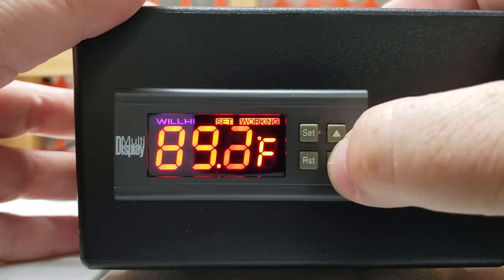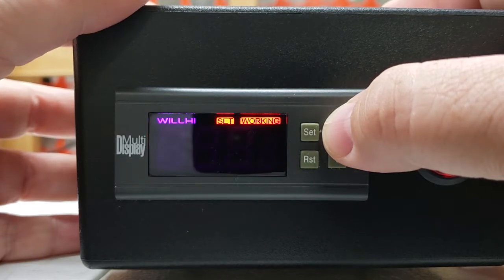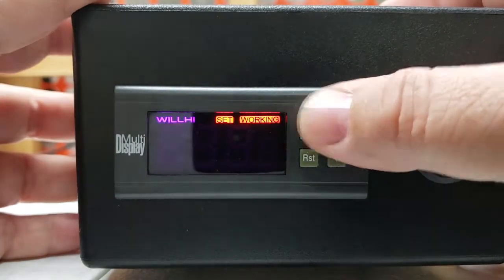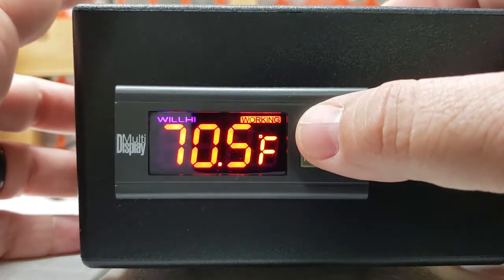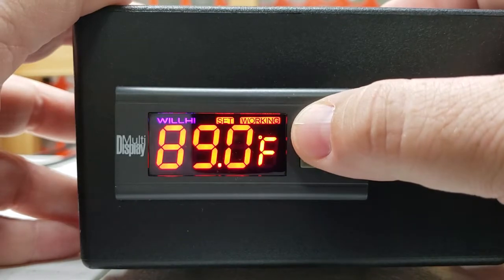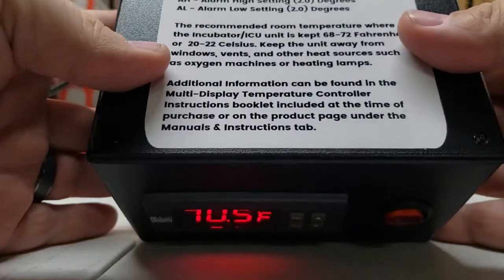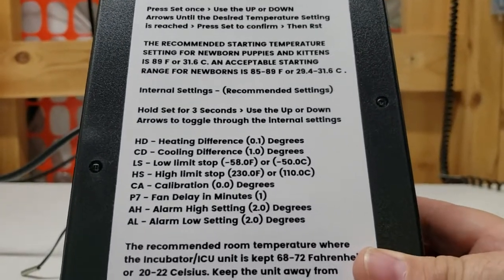We can go up or down to change that where we want it. The new puppy, kitten, and pet incubators that use the PTC style — which is a thermal resistor heating fan, much like the Arcom models using that — they use a different style heating mechanism. We recommend you set those for 89. The hinge door heat lamp models, we recommend you set those for 86 degrees Fahrenheit. In the internal settings, we preset those, and you will find that information right here for your settings.